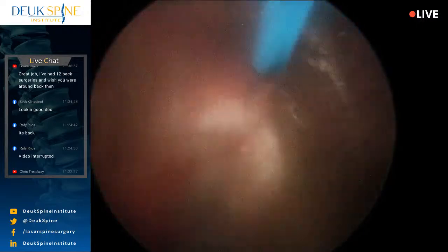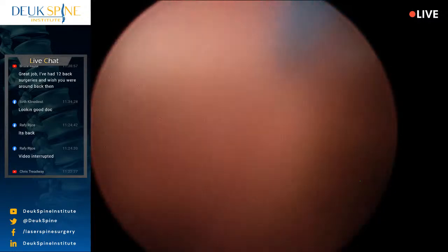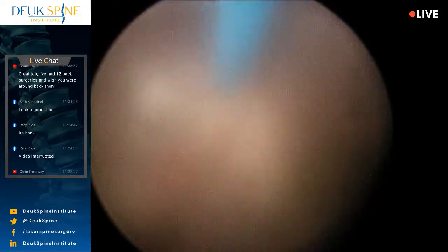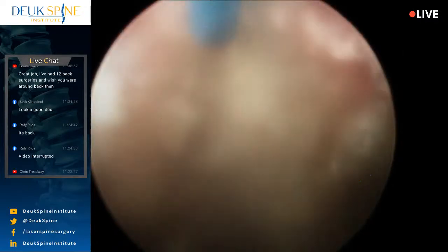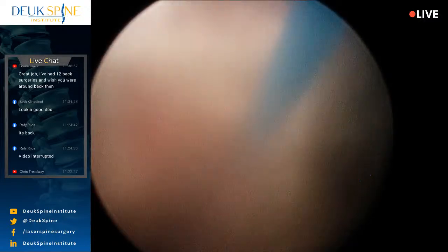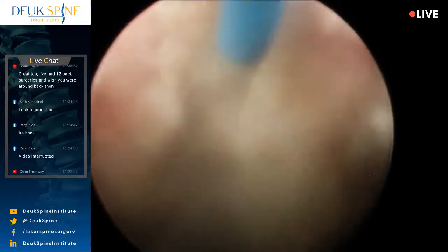All right, so we got a little bit of epidural bleeding, a little bit of fat right there. That's microscopic because think about it, those little capillaries that are bleeding right there are smaller than the laser fiber. And the laser fiber is 0.5 millimeter. So those little capillaries are almost releasing red blood cells that you can pretty much see. All right. So everything's going well for her. This is the L5-S1 disc in case you missed it.